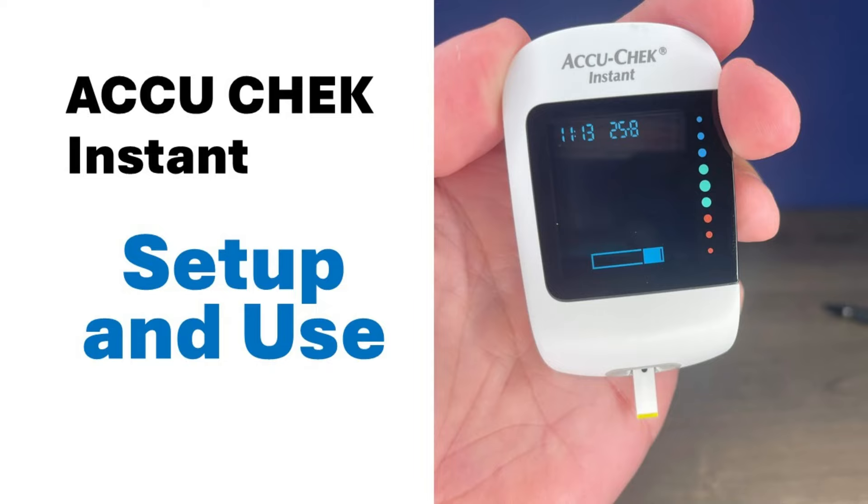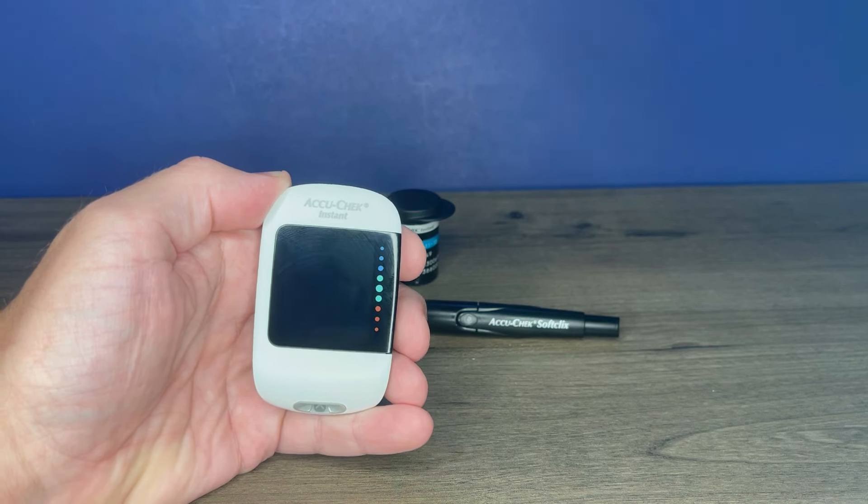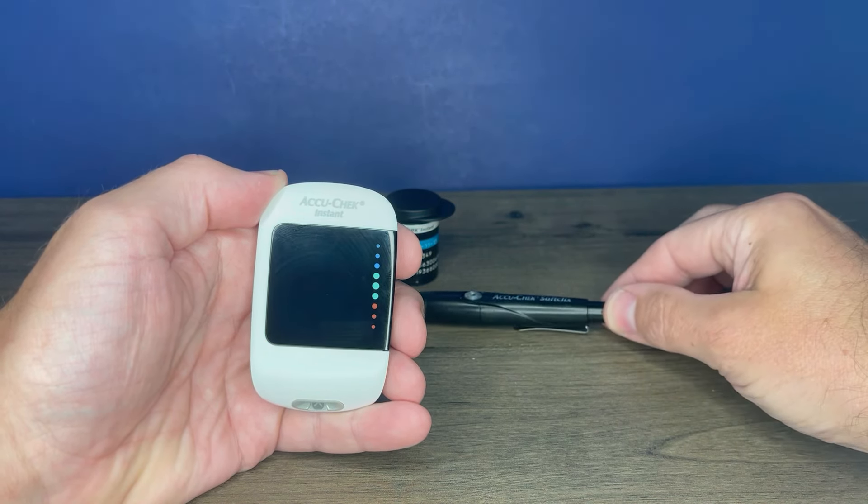Hi, this is Josh, pharmacist with Learn Blood Sugar Testing. I'm going to take a look at the AccuCheck Instant Blood Glucose Meter. We'll show you how to set that up and use it, as well as the included lancet device.